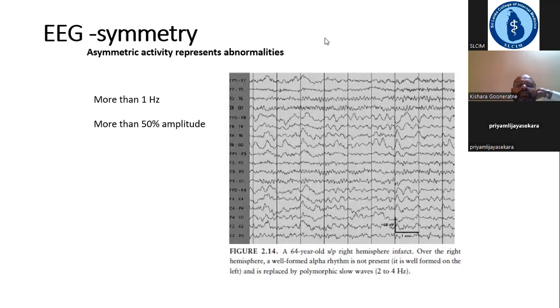It's a very good question. EEG is a tool which we use for two things. In the case of a new onset seizure where the patient has experienced a single seizure, the EEG is a tool which we use to predict recurrence.